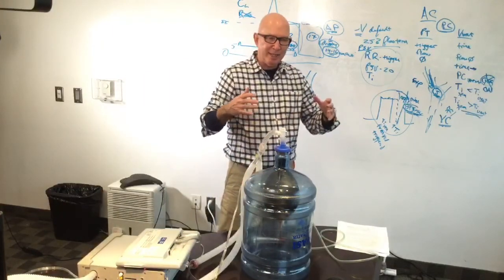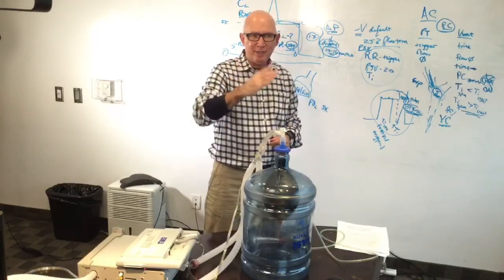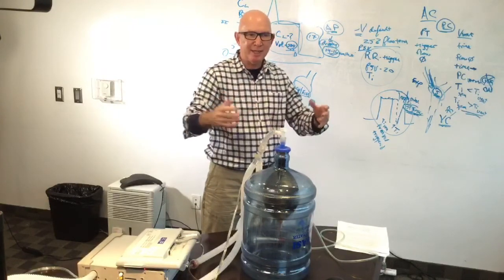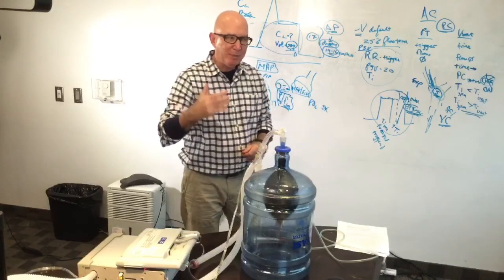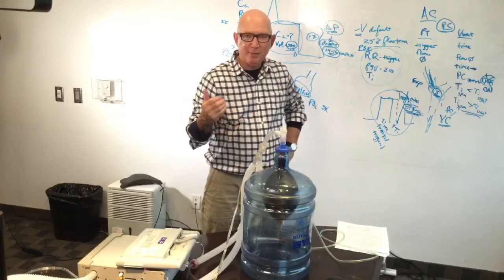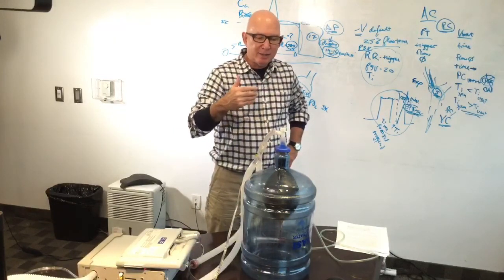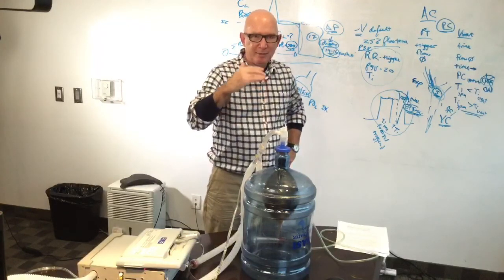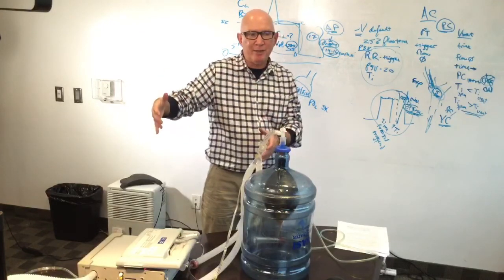The point that I want to get across to you is that if you have a patient who has ascites with a large, tight abdomen, 30 degrees in the bed is going to get you some advantage as far as ventilating, but it's not going to do everything, especially because the abdomen is so tight. And with those elevated pleural pressures, you might be wondering why it takes such high levels of peak inspiratory pressure to get a volume into this patient. It could be that your PEEPs aren't high enough. So titrate up your PEEPs, or give some consideration and discussion with the TNP to titrate up your PEEPs to counterbalance the excessive pressure of the abdomen.